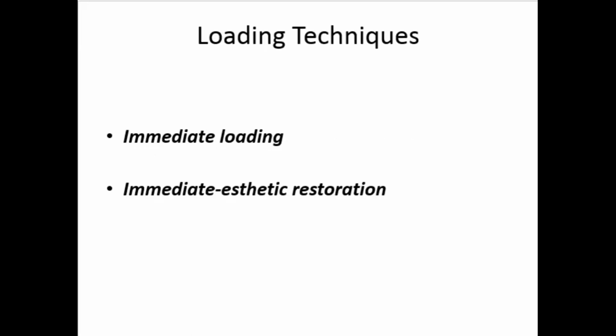Loading techniques: immediate loading and immediate aesthetic restoration. Immediate loading: implant is inserted and the abutment is immediately loaded over the implant. Immediate aesthetic restoration: impressions taken to fabricate a temporary acrylic crown, and of course it will be out of occlusion, and patient is instructed to eat soft diet.